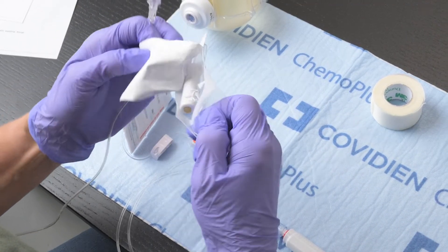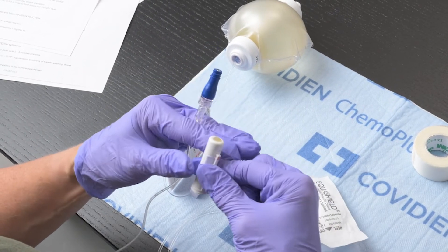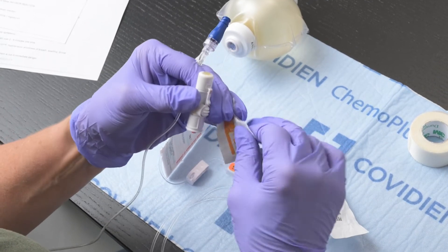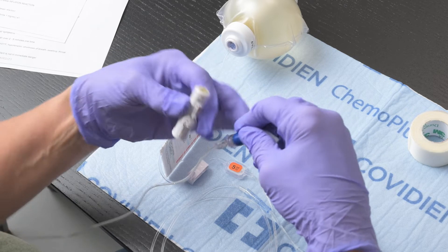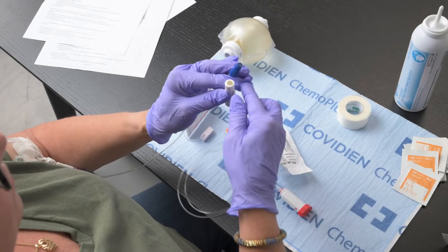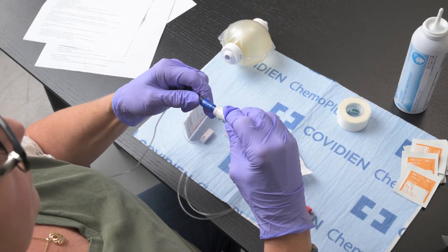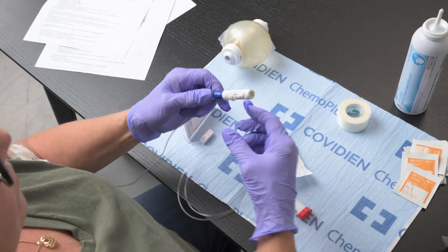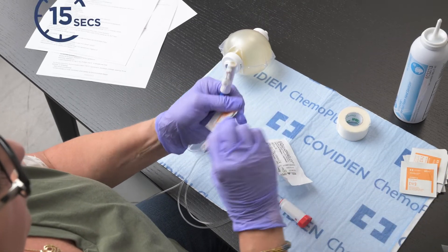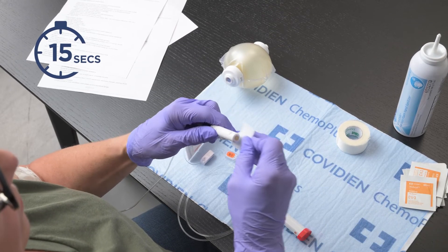Open the male connector using care not to contaminate the ends. Using a new alcohol wipe, scrub the blue end cap again for 15 seconds and let it air dry without touching it. Carefully attach the male connector to the blue cap and twist on. Take another clean alcohol wipe and scrub the end of the male connector for 15 seconds and let it air dry.